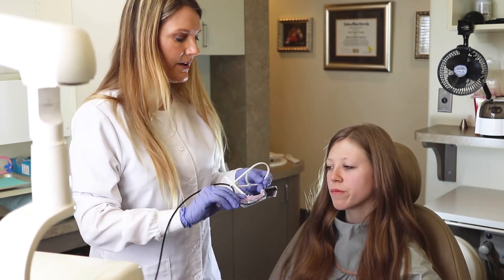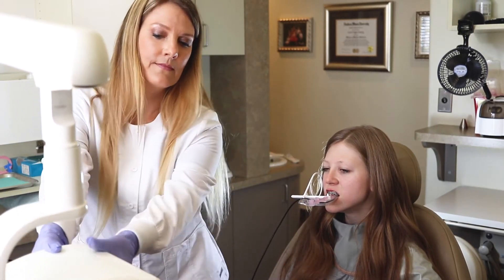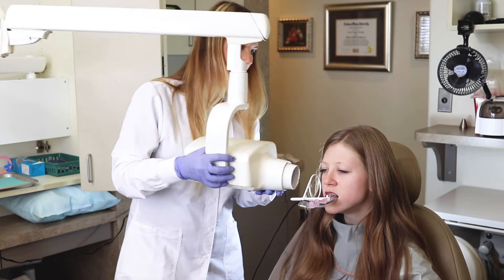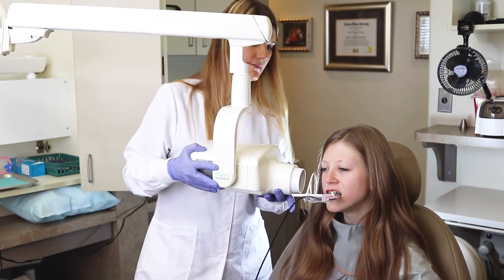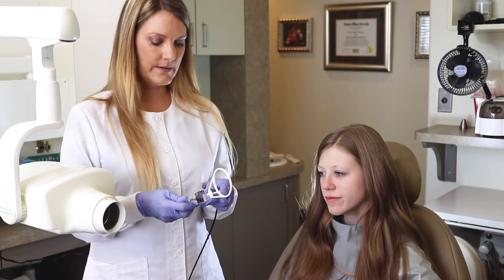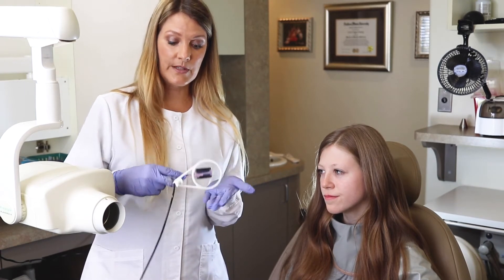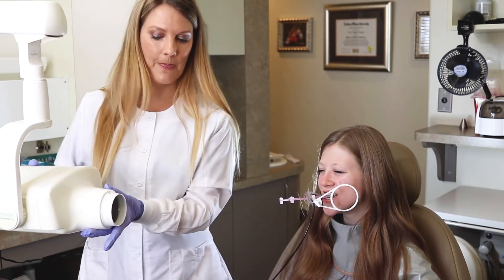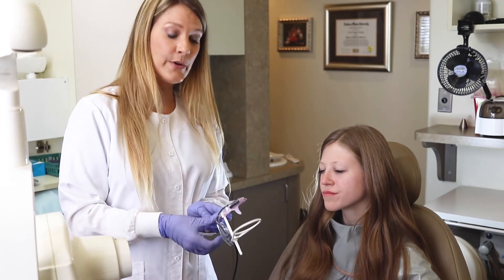Now we're going to go ahead and take that out, and we're going to take the last two uppers and anteriors. Now that we've taken the posteriors, we're going to do our bite wings. We're going to click the ring to the middle, and we're going to move the sensor to the middle position. From this view, we'll be able to take our bite wings. And now we're going to go to the other side.